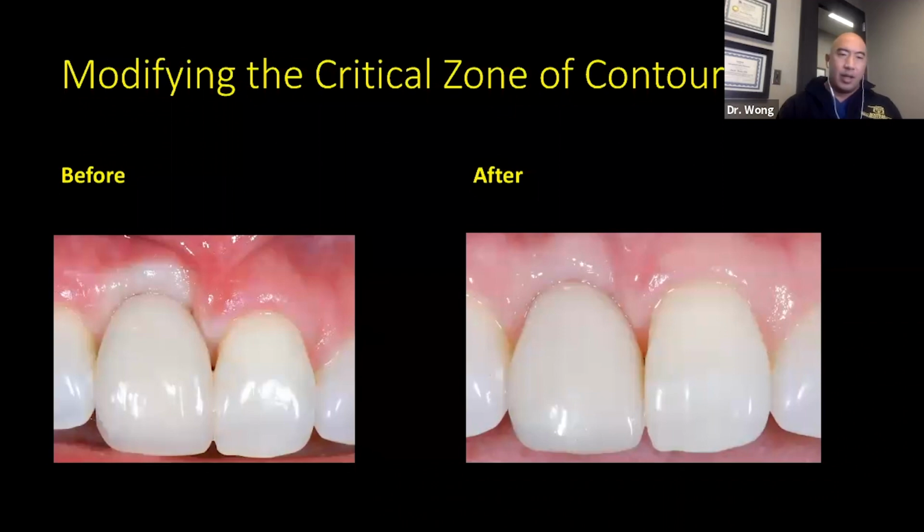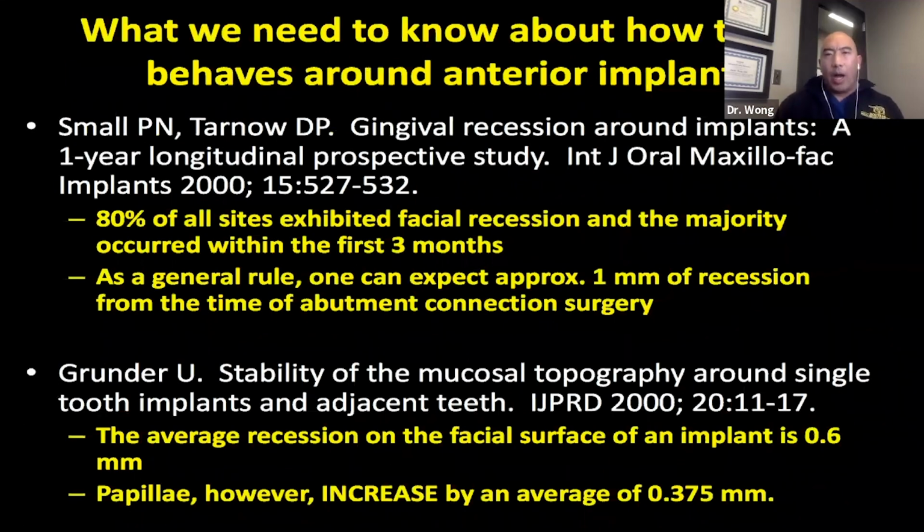All of a sudden, it's the same provisional, by the way. We can get it to look shorter. We can get it to look smaller, and it looks not bad for a provisional at this point. But more importantly, it's kinder to the tissues. This goes right on very passively. Doesn't hurt the patient.